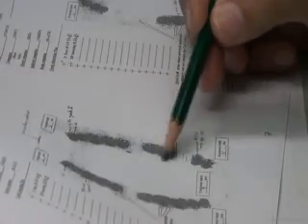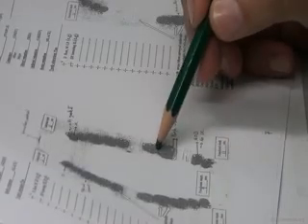Okay, high survey lines, what options do we have? In a traumatic way, lowering the survey line. Is there an atraumatic way? Now this is interfering with what? The body of the clasp, right? The body of the clasp. Can I do the clasp from here and make it a reverse Aker? This is an atraumatic way of changing my design without ruining the teeth.